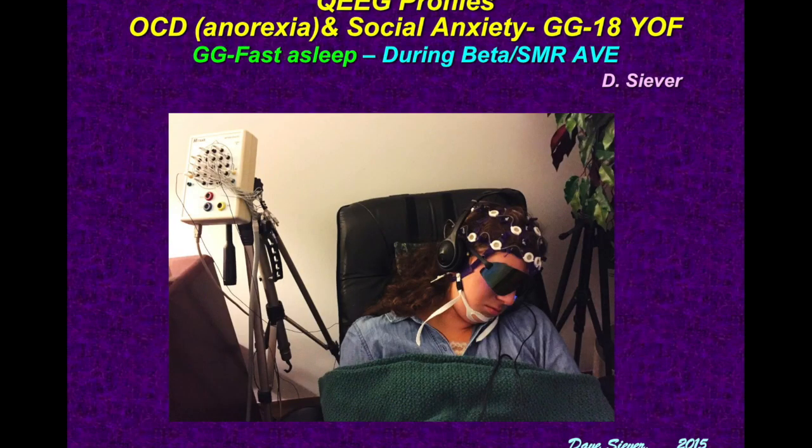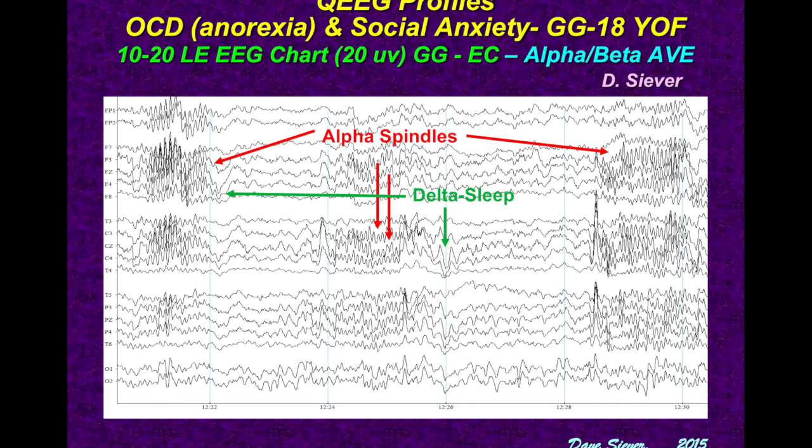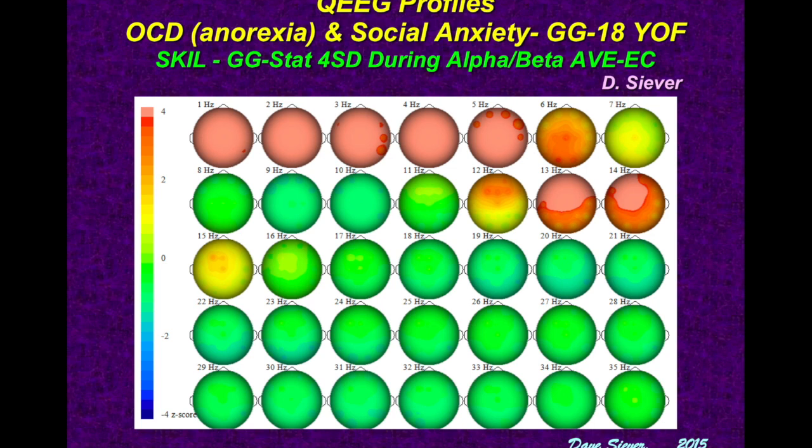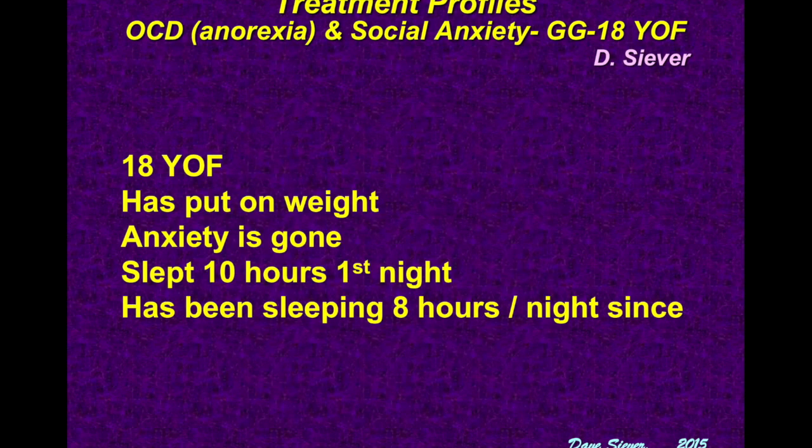Let me take you back a few slides here and take a look at this again. This is what she was before. A lot of cortical shutdown, or shutdown with reasoning and processing information, making intellectual decisions, kind of shut down in those blue areas. And here it is fired right up. Plus her brain is particularly fast at the moment. Phase, still have some phase issues. Sometimes they stand out more after entrainment because parts of the brain will kick back in and they'll start firing. And other parts then look like they have a bigger phase issue because other parts are functioning better. But this is her not long after.